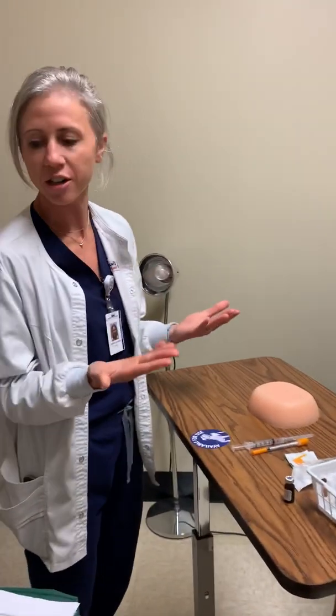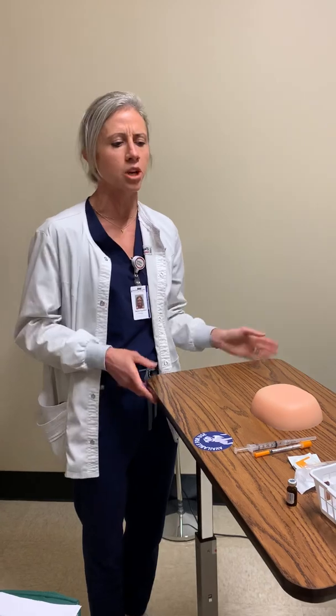So I'm going to make sure, as always, that I'm going to be washing my hands as they come in the room. I'm going to be touching my patient, right? So I should have washed them before I came in. And then I'm going to be putting on some gloves. I'm going to be donning on some gloves since I'm going to be touching my patient, okay?